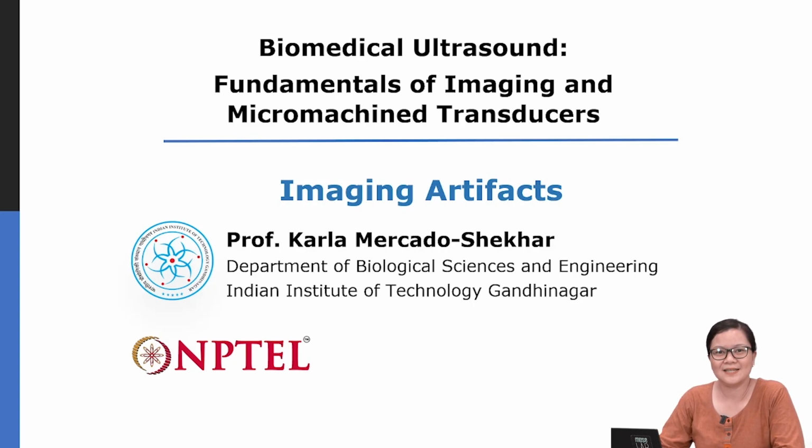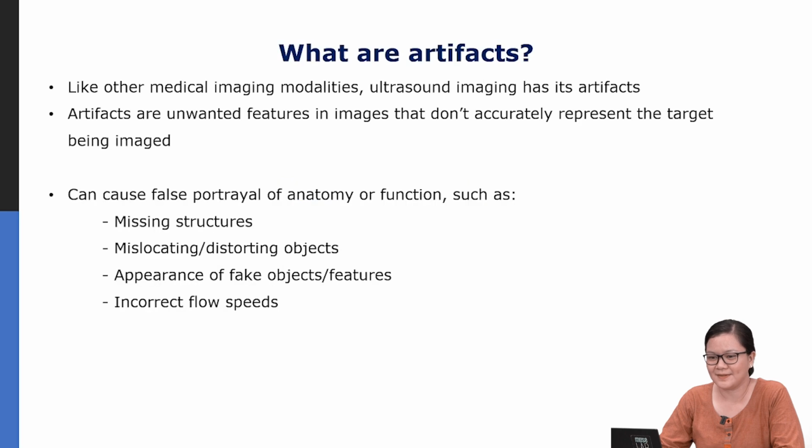Hello, in today's lecture we'll be talking about imaging artifacts. Now, what are artifacts? Like any other medical imaging modality, ultrasound also has its own artifacts. And artifacts are unwanted features in the images that don't actually represent the target of interest. And it can cause false portrayal of the anatomy or function.